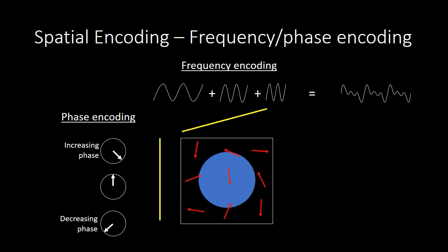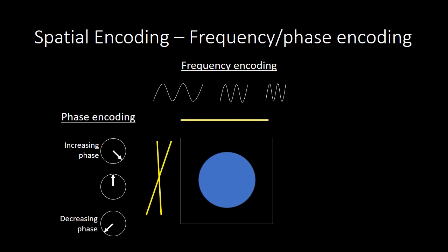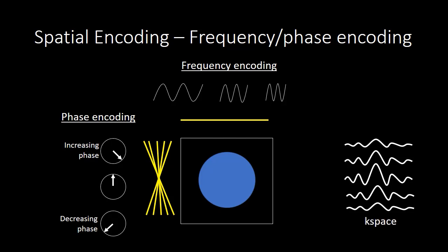And so now if we look at our signal, again, it's made up of multiple frequencies, but in this case, it's slightly lower amplitude because the previous phase encoding had caused some phase dispersion, which reduced our total signal amplitude. And in order to generate an image, we actually have to repeat this phase encoding gradient multiple times to sample along this dimension. And we use the multiple signals that we acquire to fill up our K-space, so this is time-varying signals. And then with a two-dimensional Fourier transform, we can turn that back to frequency space, which tells us about our image.